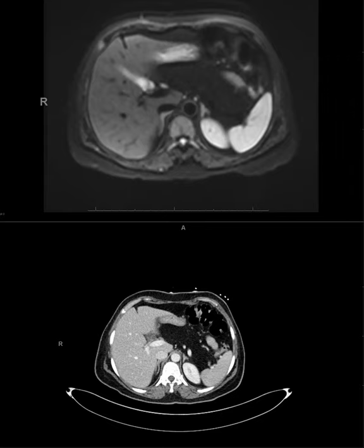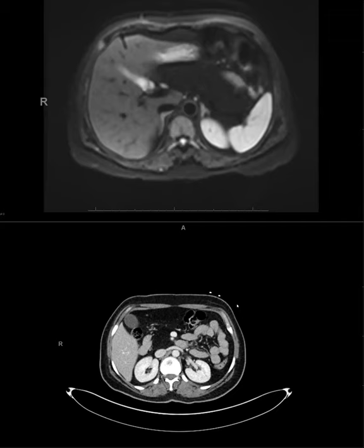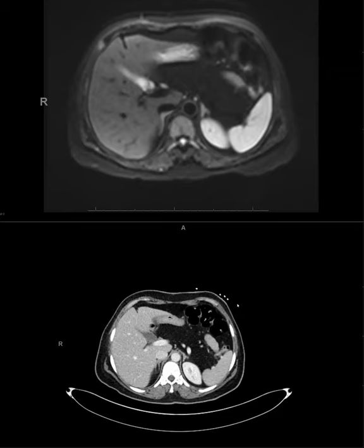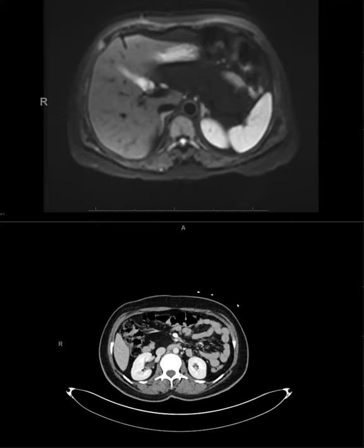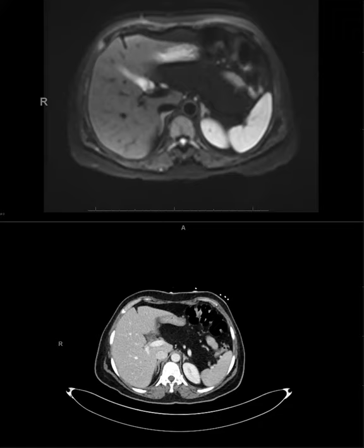It's called lipomatous pseudohypertrophy of the pancreas. Lipomatous pseudohypertrophy of the pancreas. Because it does look like the pancreatic bed is a little bit plump, and yet the plumpness is due to adipose and not a plump pancreas. And they are treating the patient for exocrine pancreatic insufficiency, which is somewhat effective at improving the symptoms. You guys still there?